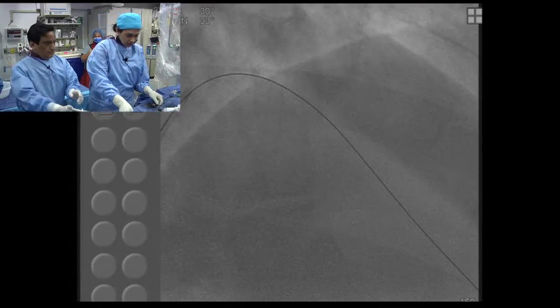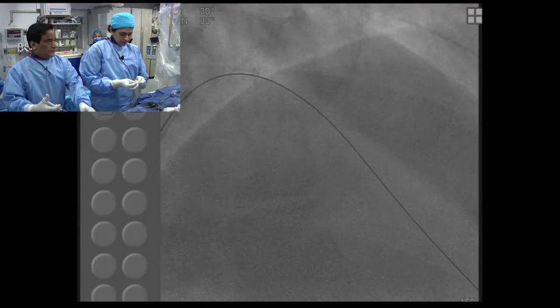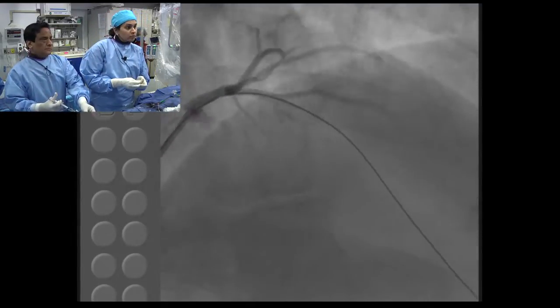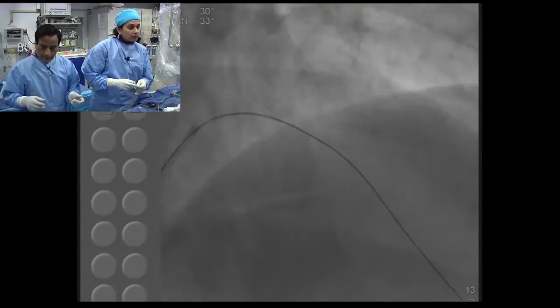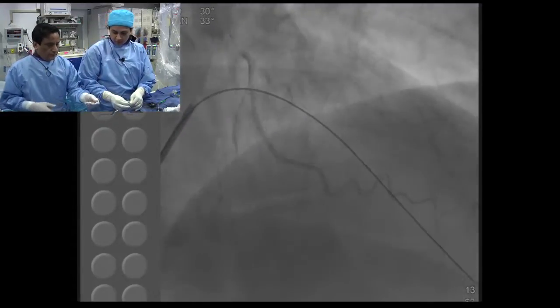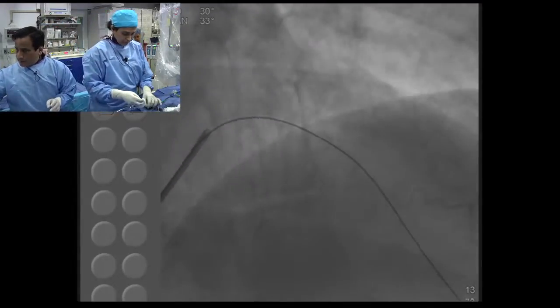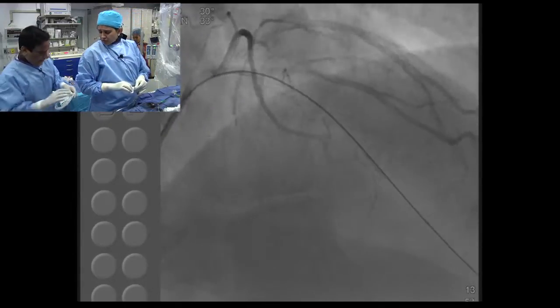Careful, don't pull. Okay, go. Cine. Good. I think that's a little more antegrade flow. Long balloon? That's how I would say. Forget the other, 30 millimeter? Go there. 2.0 by 30? Yeah. What did you want? The 30 millimeter and six quantum apex.